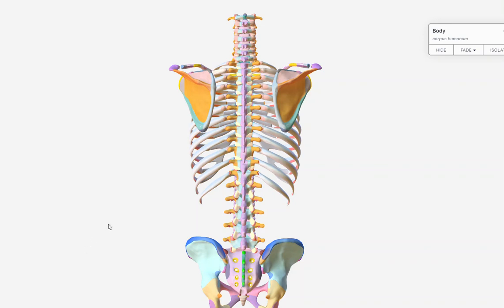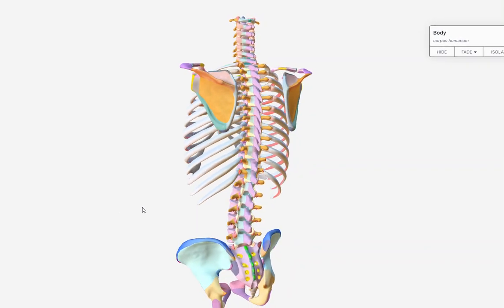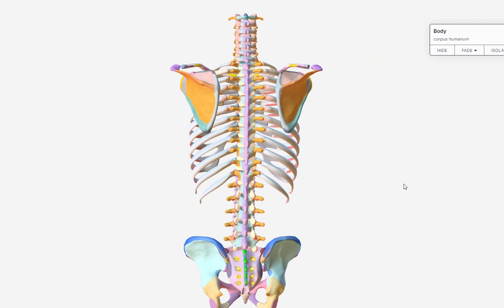So if I rotate my patient so that their right scapula, I took their arms off so that we could look at the ribs later, but what I'm doing is I'm rotating. The right scapula is going toward the bucky, toward the whiteboard, towards the table. That is called a right anterior oblique. The left side is coming away from the bucky or the table. Right anterior oblique. Put them back in PA, straight PA position, straight PA projection.